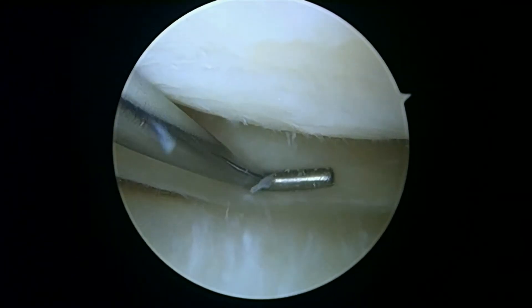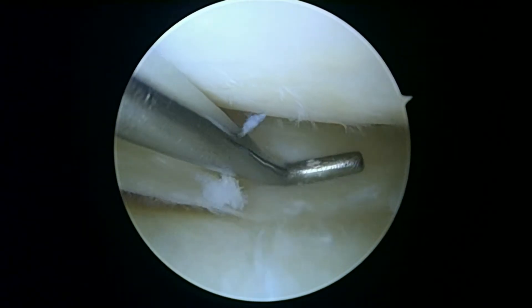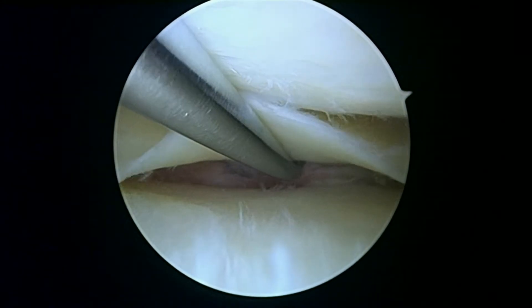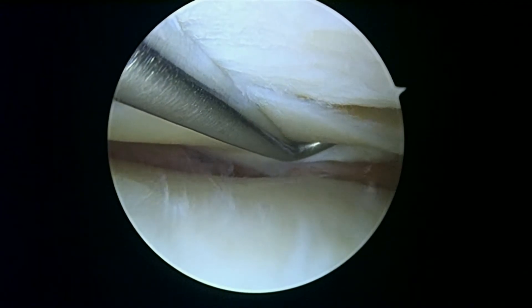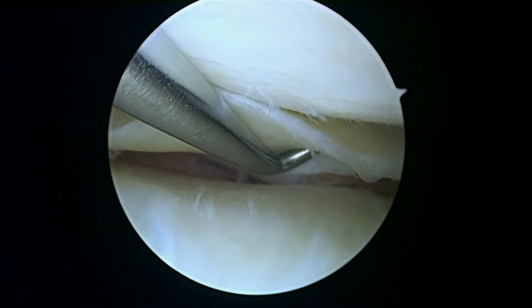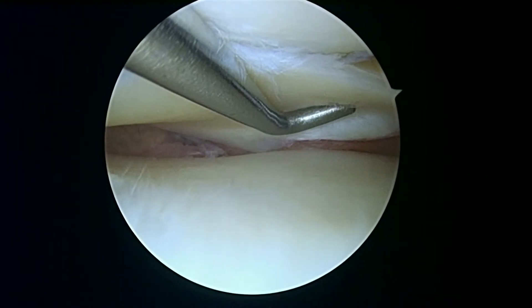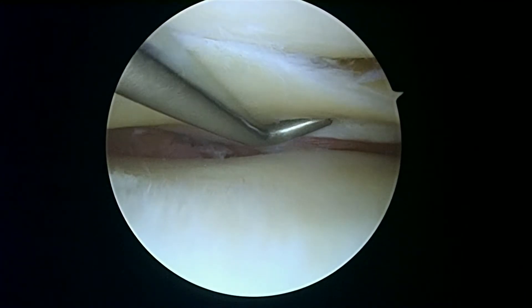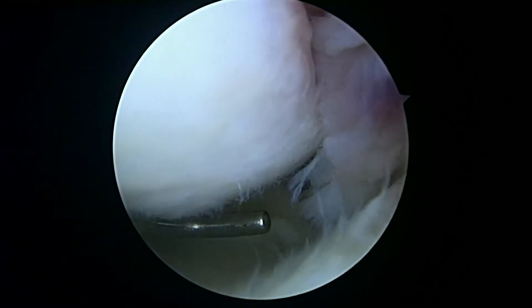That's pretty stable, though. We could always put in a stitch, whether vertical or horizontal, to try and hold that down. I can't demonstrate any instability there. We're going to keep looking. We're getting a good look at this posterior horn — you can kind of see where the meniscus lit up on the MRI scan, because just underneath it's white on the MRI slice. But it's not unstable. I can't really justify putting in a suture.